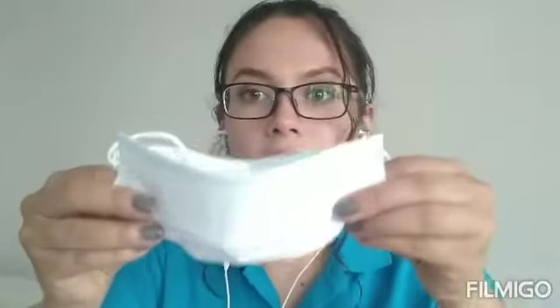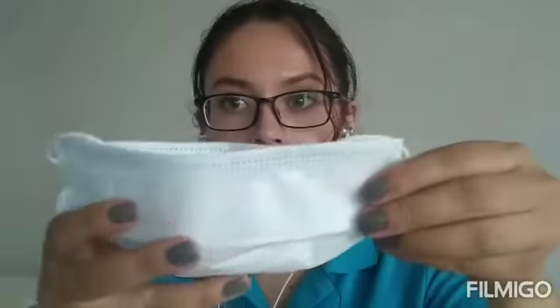I have another mask that I prepared previously with water. The water has been here for about 5 minutes, and it did not penetrate the mask. The main function of the outer layer of the mask is to prevent water from splashing in.